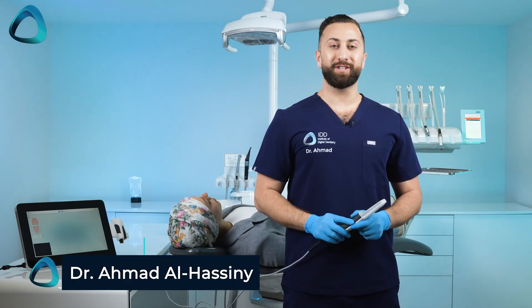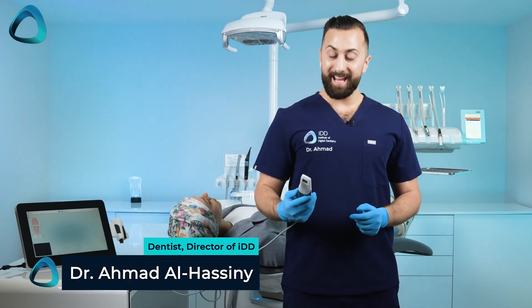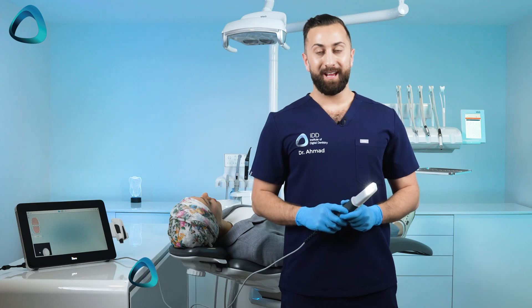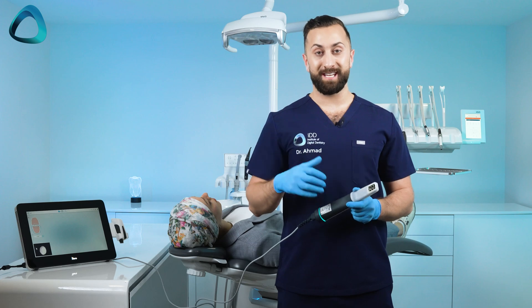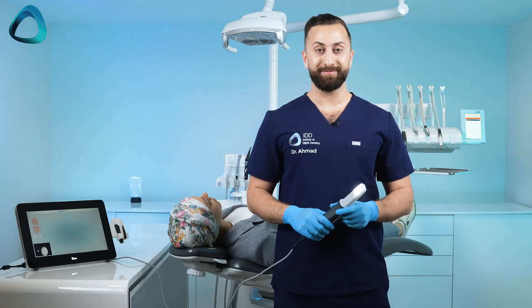Hey everyone, Dr. Ahmad Al-Hassiny here from the Institute of Digital Dentistry. Today I have the iTero Lumina. A common question I get asked is how does it scan? So I figured let's just take some full-arch scans and you can decide for yourself. Let's do it.